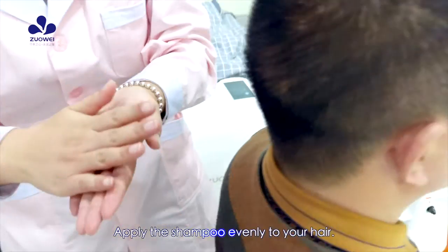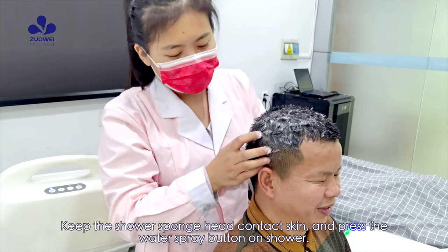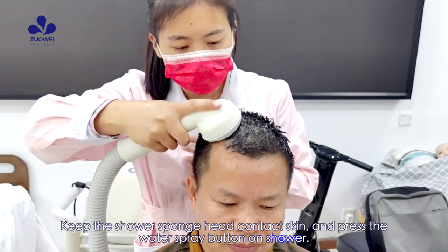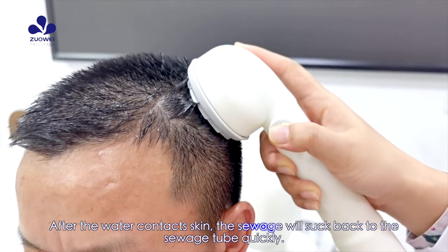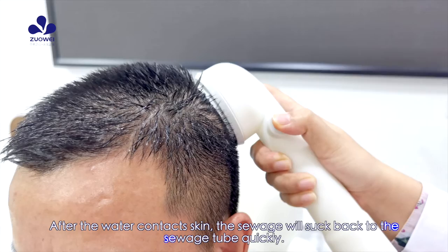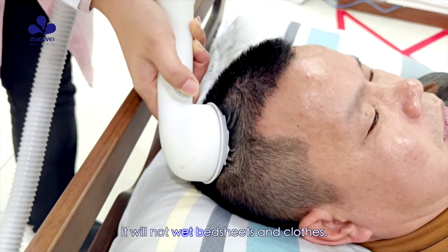Apply the shampoo evenly to your hair. Keep the shower sponge head in contact with the skin and press the water spray button on the shower. After the water contacts the skin, the sewage will be sucked back into the sewage tube quickly. It will not wet bed sheets and clothes.